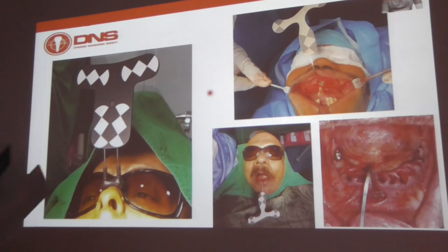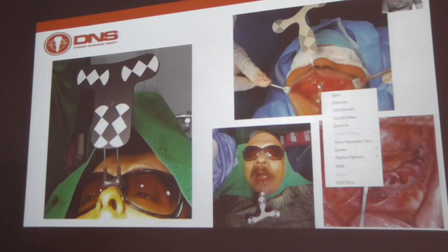Like a debate, I use head tracker when I am sure that the patient is compliant, and now my staff is trained not to touch it. Initially, they would punch it, I would repeat it, but with bone screws, registration is 30 seconds. So even if it moves, I do not waste time to retrace. But if bone tag has been placed, you don't have to see it for 6 hours, 10 hours, no problem. So I would say still gold standard is bone anchorage, your first choice. First choice, but head tracker can 100% be used. So each choice.